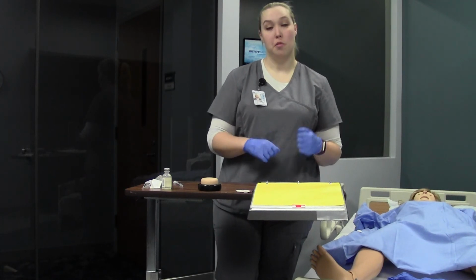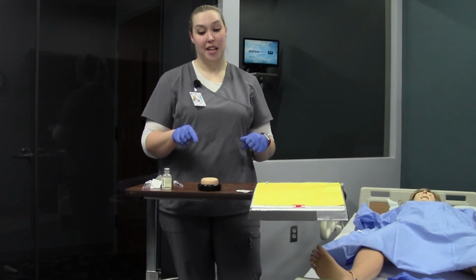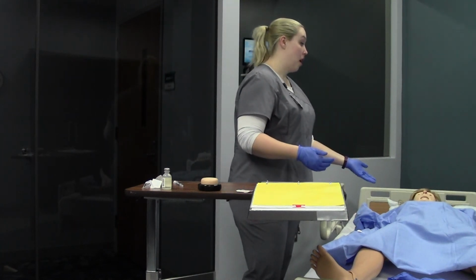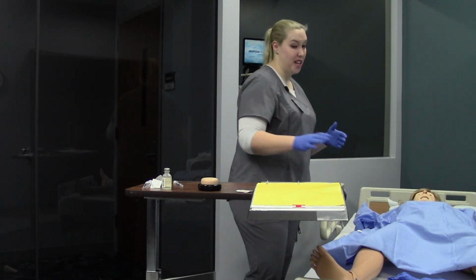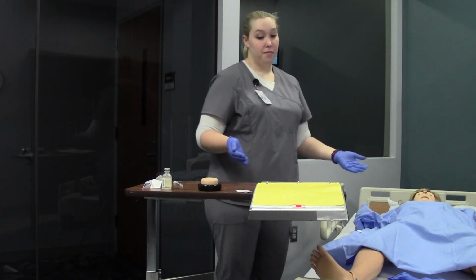You're going to then document the date, time, and location on your card as well as your MAR, because your patient will need to bring that card back in 48 to 72 hours to get their TB test read to make sure that it was either negative or positive. And make sure you let your patient know that, all right, Mr. Smith, I'm done with the injection. Please remember to come back in 48 to 72 hours to make sure that we get our test read to see what our results say. And that's it.